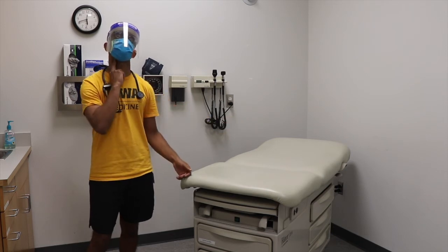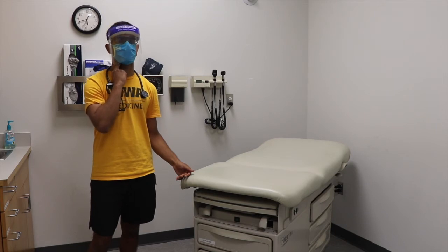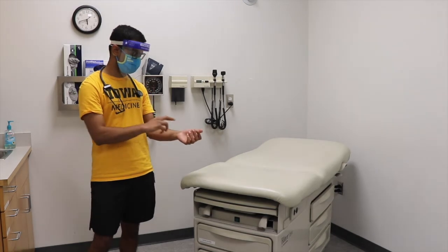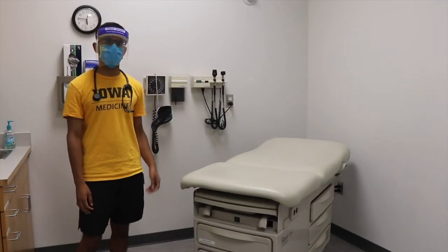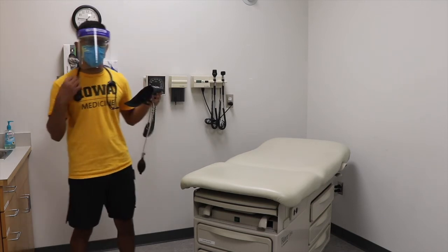And you can also feel it underneath your jaw on your neck at the carotid pulse. So right here you have your carotid artery, you have your brachial artery running over here, and your radial artery. All right, so to measure blood pressure, we use 2 things. We use a blood pressure cuff right here, and we use a stethoscope.